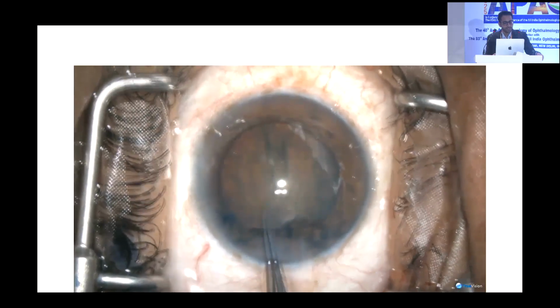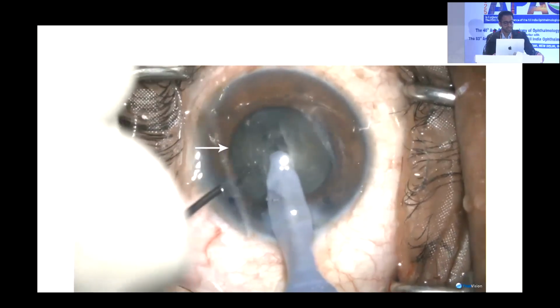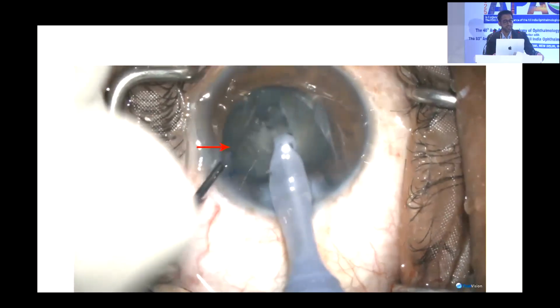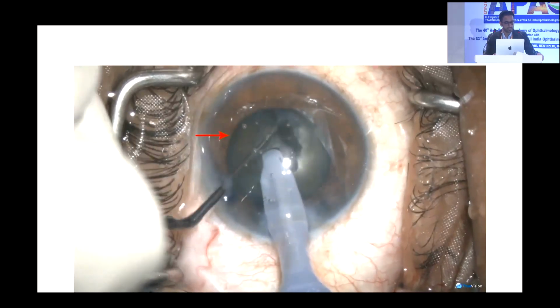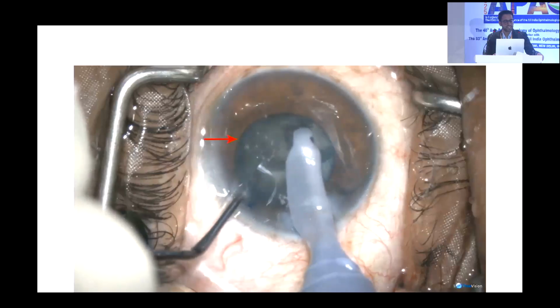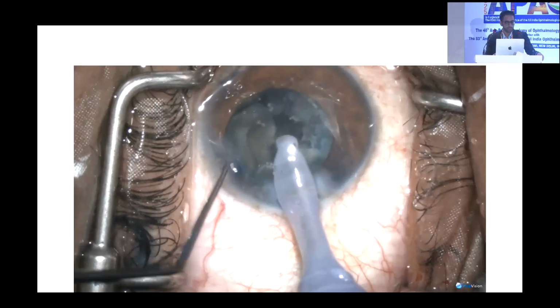As a flap motility sign, whenever you have an anterior capsular tear and the flap stops fluttering, you should be aware that some catastrophe has happened. The tear has gone posteriorly, but the fellow, oblivious of the flap motility sign, kept continuing phacoemulsification, the flap had stopped fluttering, and it led to a nucleus drop.